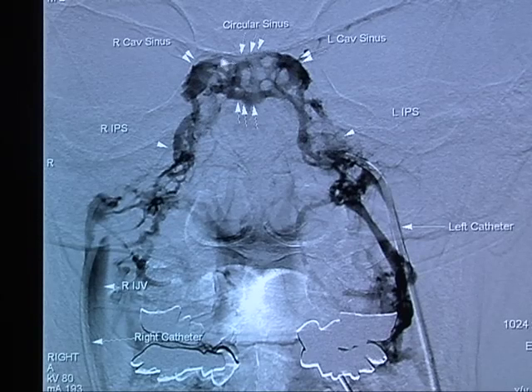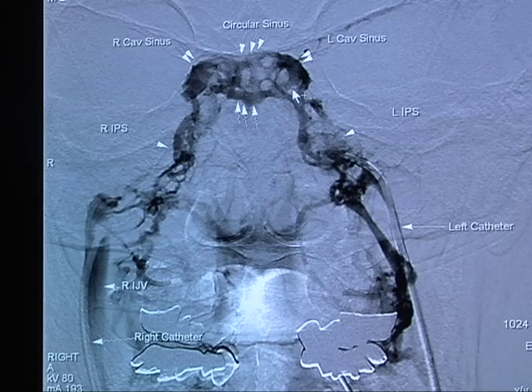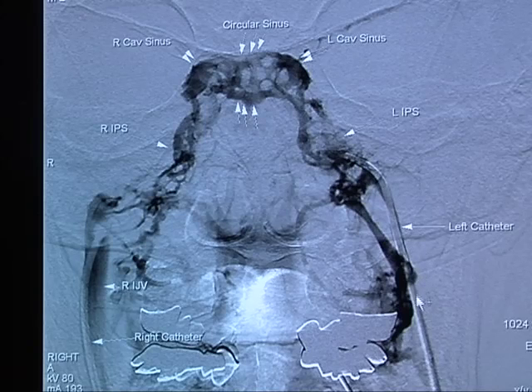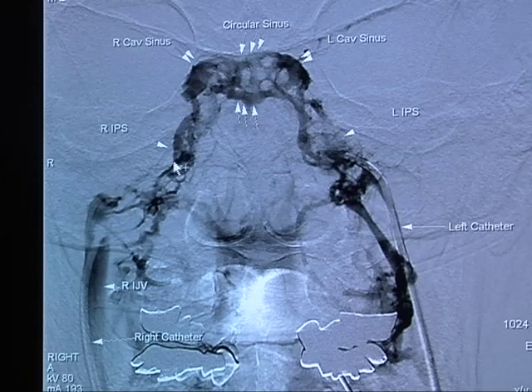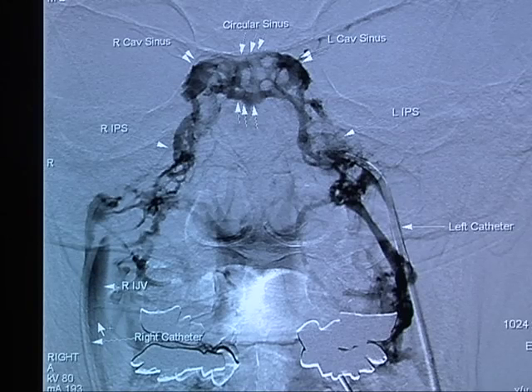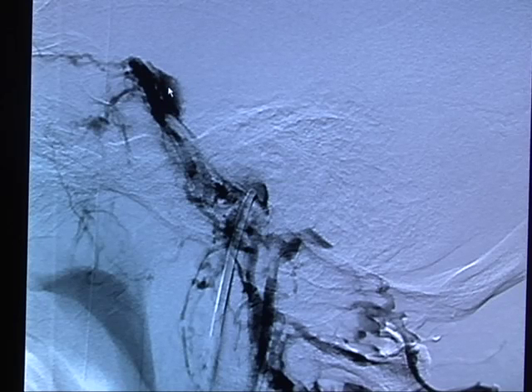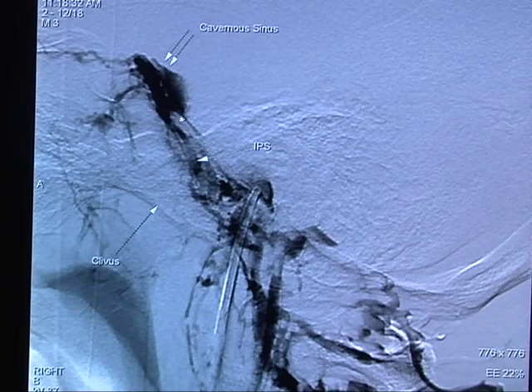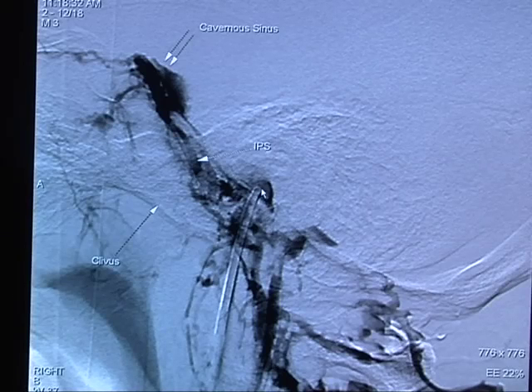Here we show the right and left cavernous sinuses and the left inferior petrosal sinus. On a lateral view, the right cavernous sinus connects to the right inferior petrosal sinus, with the catheter at the ostium to the inferior petrosal sinus. The clivus is labeled.